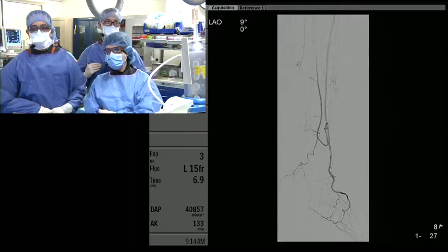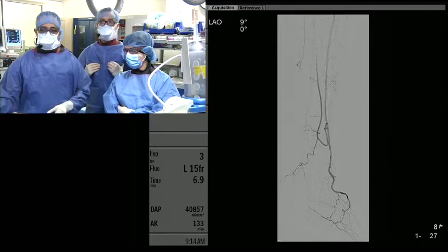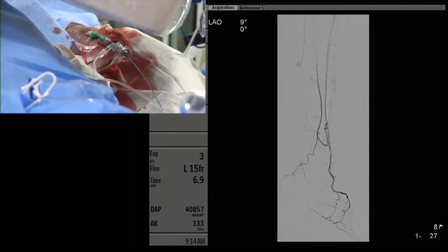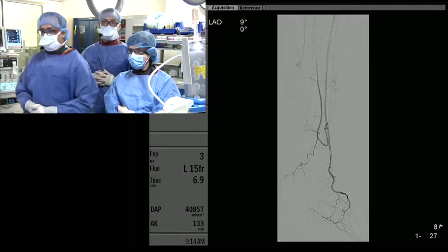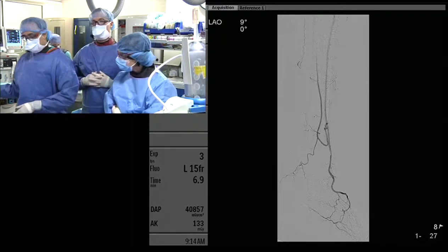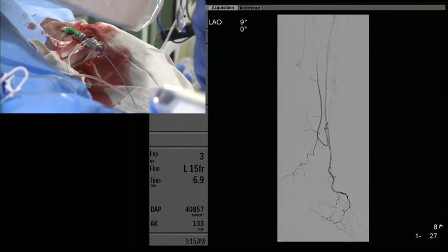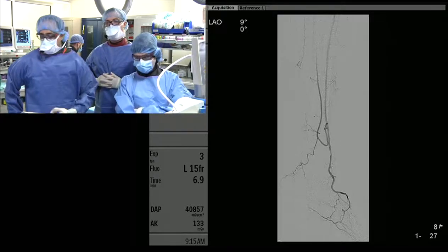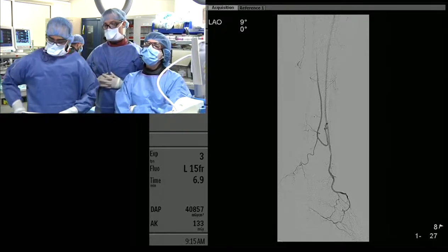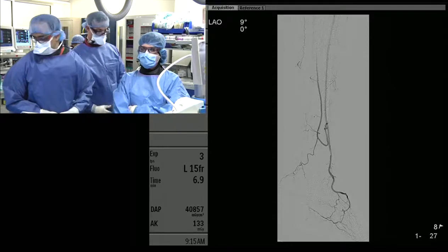Our initial plan was a six-French destination slender sheath for the radial-to-peripheral R2P system from Terumo. Since we're going to just balloon it and she's quite short, we're going to try doing this all through a six-French guide — a six-French MP guide from Boston Scientific, 110 centimeters in length — which gets you right into the proximal SFA in this patient. We have an Amplatz wire across the occlusion using an angled glide catheter and glide wire, placed distally into the popliteal. We're going to do pre-dilatation with a five-millimeter Evercross balloon, which is 135 centimeters.